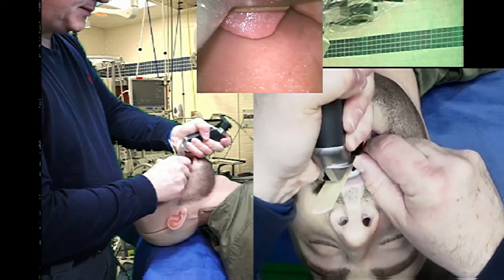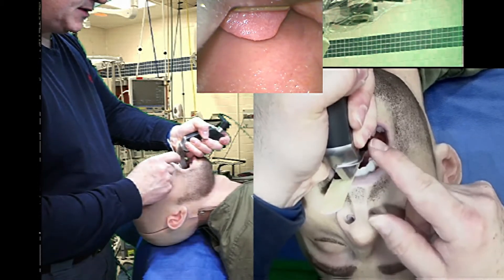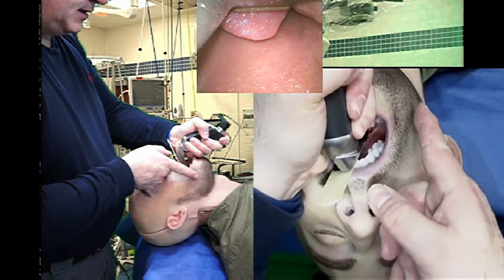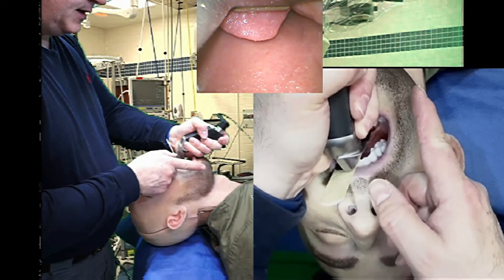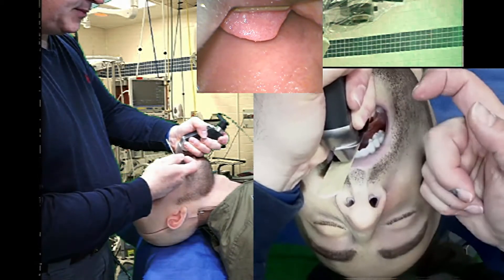I'm going to come around the base of the tongue. You can see the tip of the epiglottis on video laryngoscopy. For me to get the tip of this laryngoscope blade a little bit more anteriorly and a little bit more into the vallecula, I'm going to do the salad pinch.